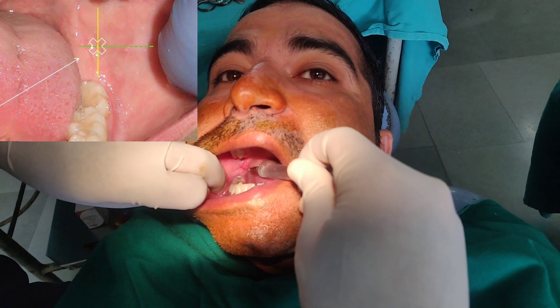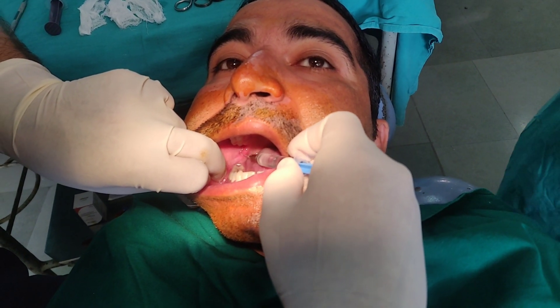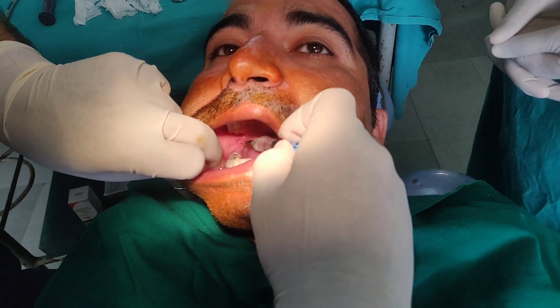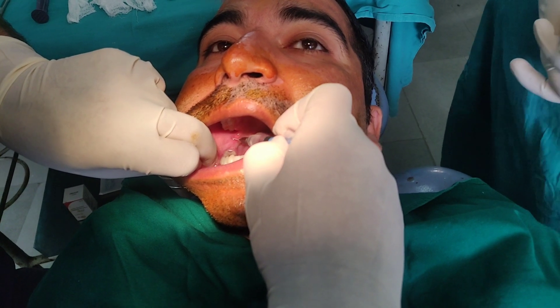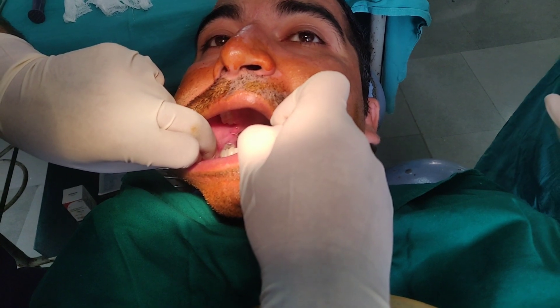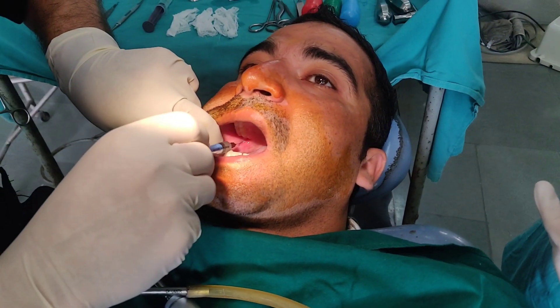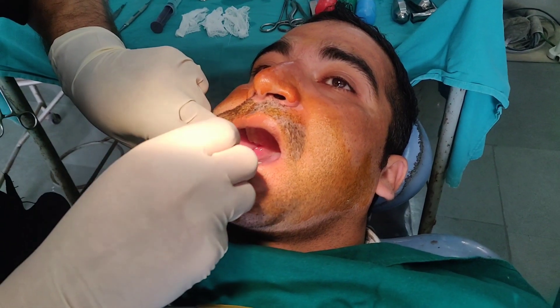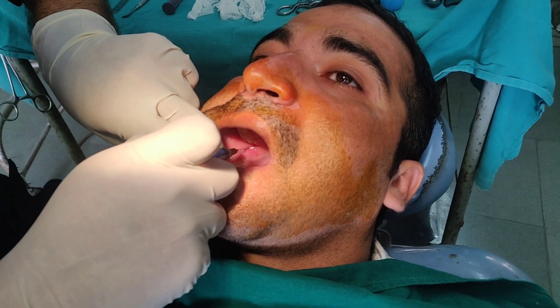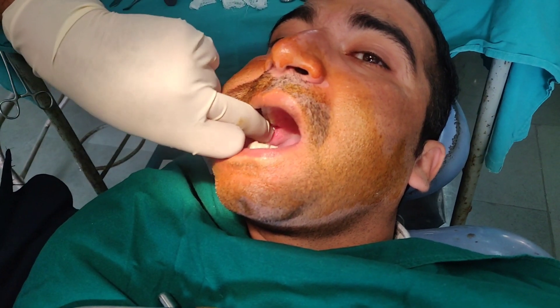Insert the needle from the opposite side and aspirate. It should be a negative aspiration. Then deposit 1 to 1.5 ml of the solution — your needle should have hit the bone. After that, move your hand slightly and deposit another 0.5 ml, which will anesthetize the lingual nerve. And it's done.